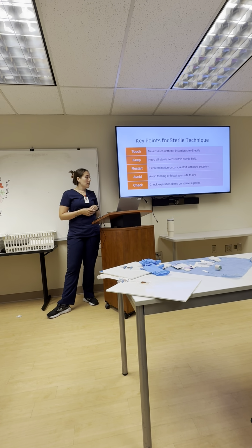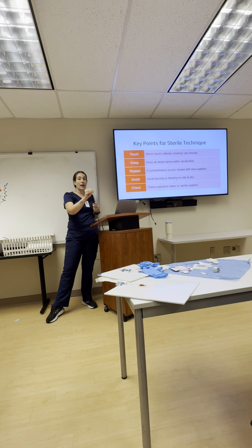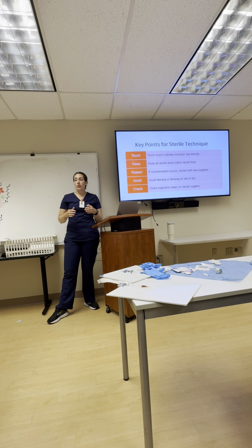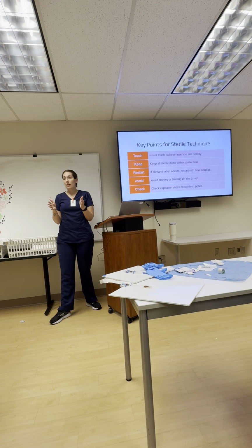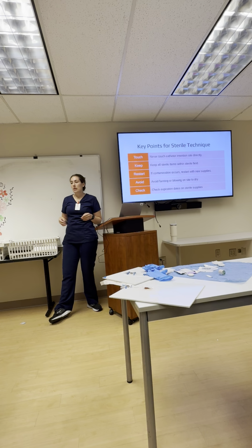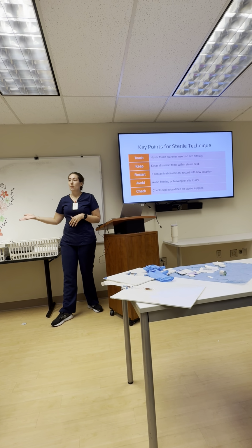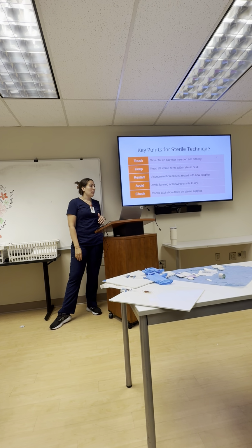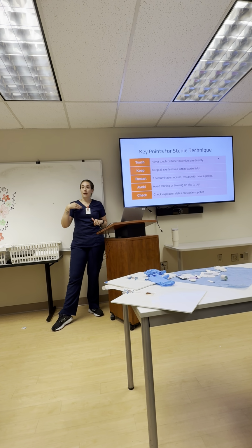And then some key points for sterile technique: never touch the catheter site directly. That's why we want to use that gauze. Keep all sterile items within the sterile field. I like to keep about a 2-inch barrier at the edge of my sterile field to make sure all my supplies are within that range. If a contamination occurs, just throw the entire packaging out and you can get a new one. Better safe using extra supplies than causing the patient an infection later on. And then avoid fanning and blowing. Like I said, we don't want to be bringing bacteria back into the insertion site. It's going right into our heart.